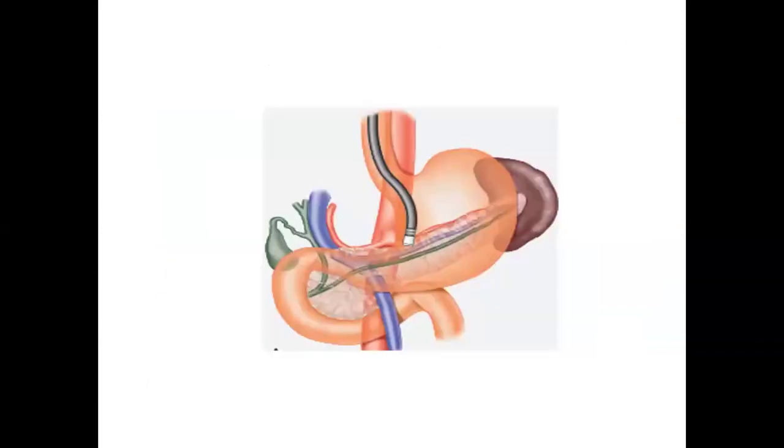So in this case, we are in the stomach. Just like in the direction the scope is pointing, we're able to visualize all the structures underneath there. We can see the pancreatic duct. We can see the walls of the stomach. We're able to visualize even structures around that.